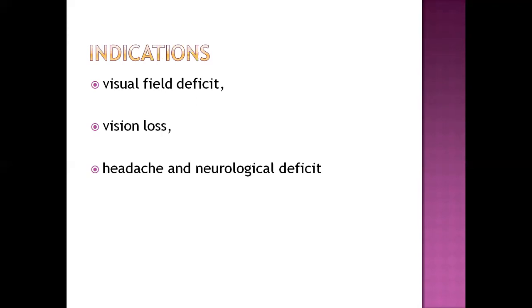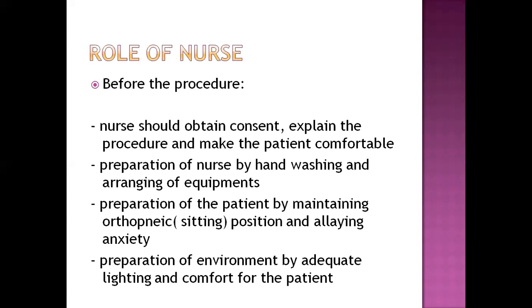Indications of this test are visual field deficit, vision loss, headache and neurological deficit. Again, role of nurse. How can nurse participate in this procedure? Before the procedure, nurse should obtain consent, explain the procedure, and make the patient comfortable during the test.